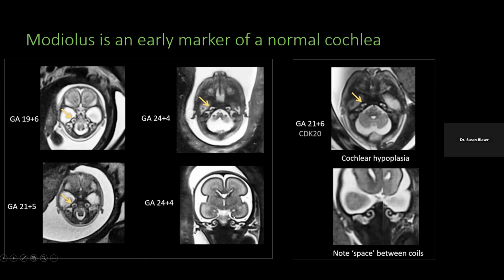Here is your coronal view of your actual cochlea. That's going to be the modiolus here and here. Again, ossicles. Here is going to be your tympanic cavity and extending out into where you're ventrally going to have the eustachian tube. Here's one that's not normal.